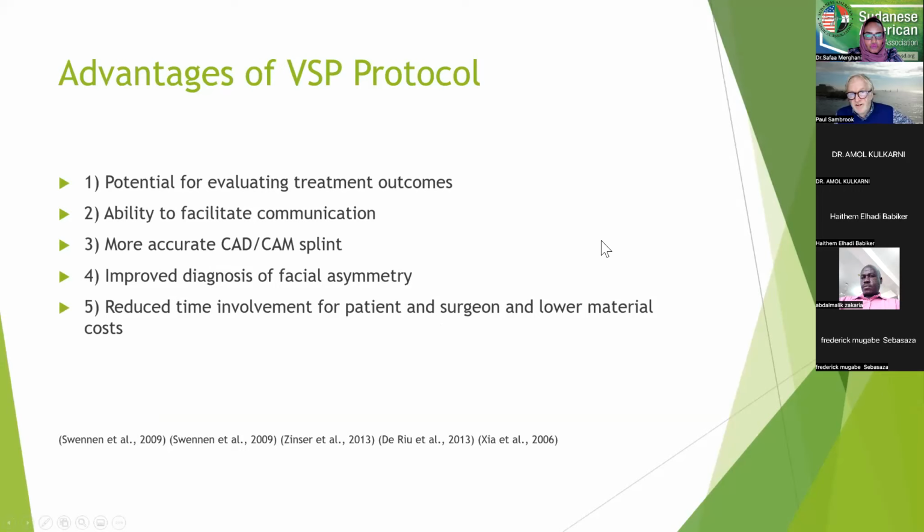So what are the advantages of a VSP protocol in orthognathic surgery? We have a far greater potential for evaluating treatment outcomes. However, we need to balance that against the radiation exposure that these patients may have. These sorts of scans allow a greater facilitation of communication with patients and a greater understanding of the sorts of procedures that you're going to do.